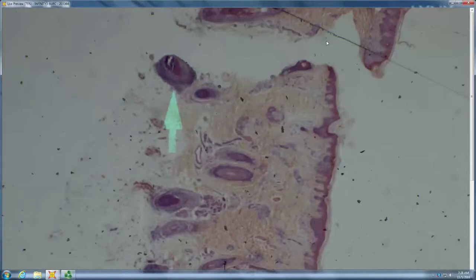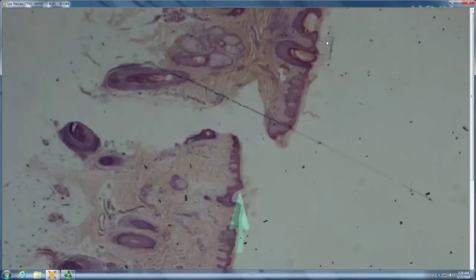Inflammation around the bulb, and is it lymphoid or suppurative? Lymphoid. So tell me things that can give you lymphoid inflammation around the bulb. Alopecia areata or syphilis. Correct. And they pretty much look identical. And then if you look here, there are all of these little hairs that are kind of twisty-turny and have lots of apoptotic cells, so those are all catagen hairs, and that again is a feature of both alopecia areata and syphilis. Pigment casts in the follicular channel can be a feature of both alopecia areata and syphilis.